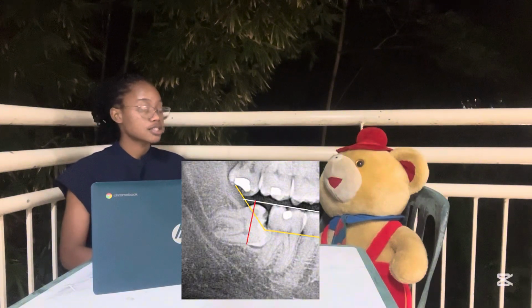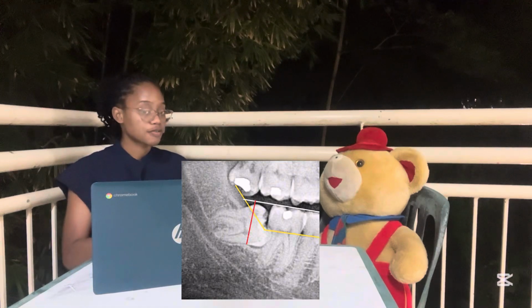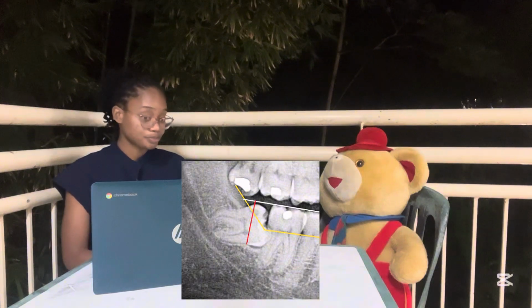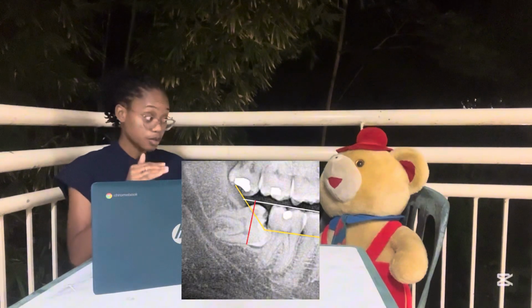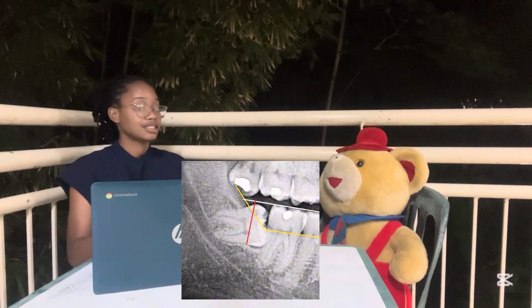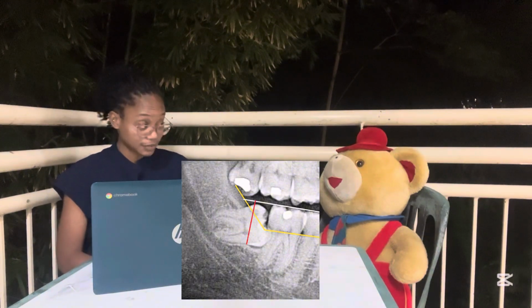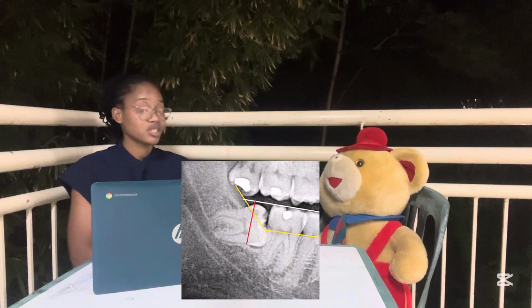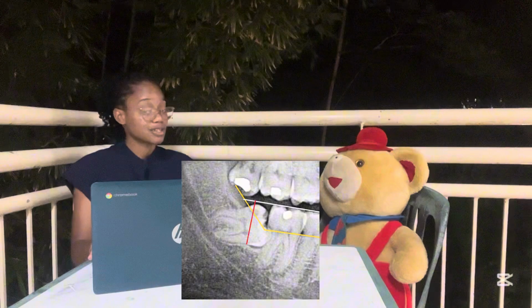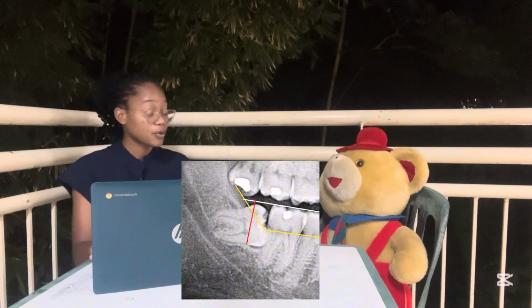The red line is dropped perpendicular from the white line to the point of application of an elevator, but is measured from the amber line to the applicable point. And this measures the depth of your wisdom tooth in the mandible. If that red line is more than 5 millimeters in length, the extraction is considered sufficiently difficult. As the average width of a molar is approximately 10 millimeters, from this diagram, we should both be able to agree that the length of the red line from the amber line to the applicable point is more than 5 millimeters.